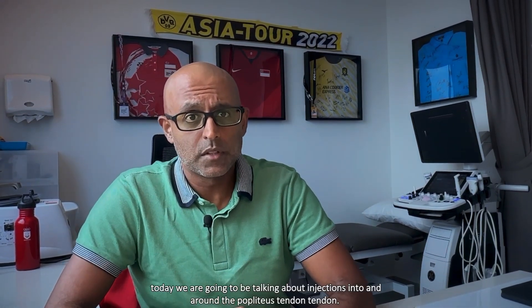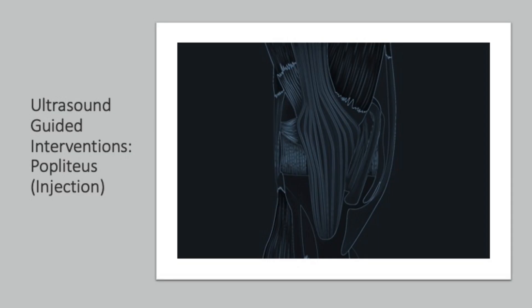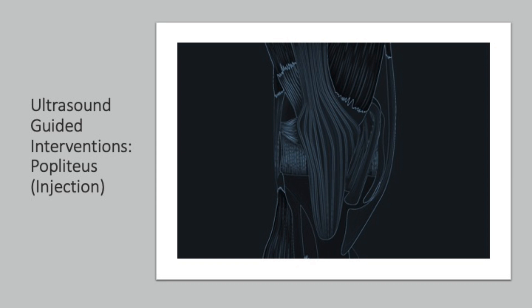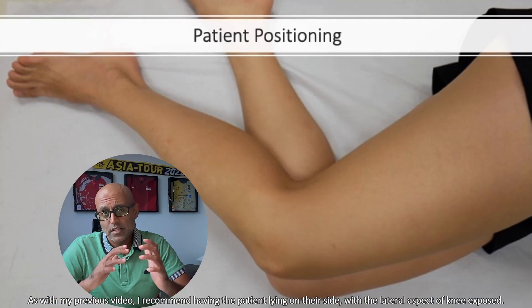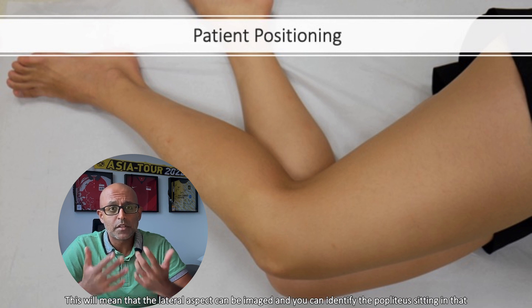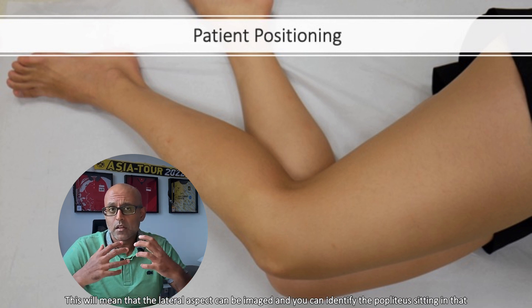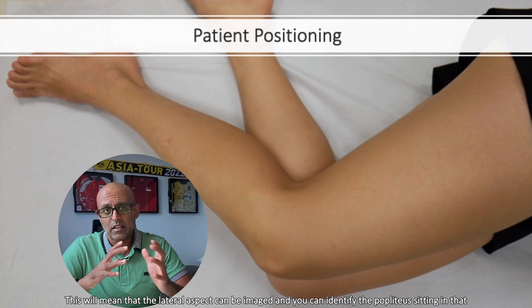Hi everyone, Dinesh Sarasana here, and today we're going to be talking about injections into and around the popliteus tendon. As with my previous video, I recommend having the patient lying on their side with the lateral aspect of the knee exposed. This will mean that the lateral aspect can be imaged and you can identify the popliteus tendon sitting in that location.